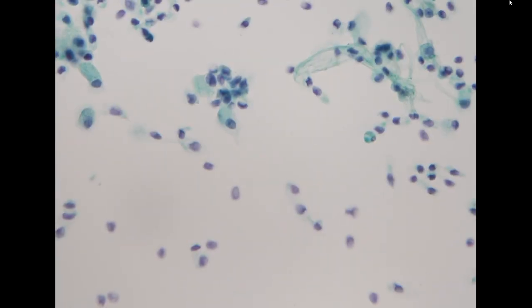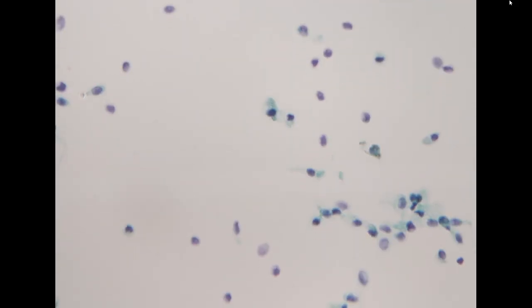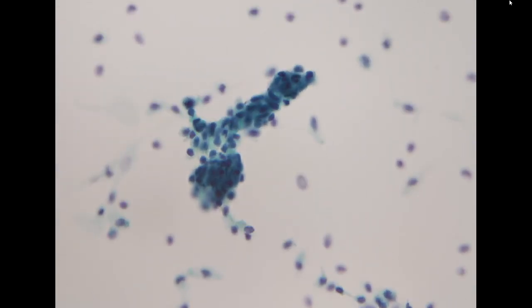and all of these cells have mild atypia, where you don't see a normal NC ratio. The NC ratio is slightly increased, and you feel like most of the cells look the same. This is uniformity, or what we call a monotonous appearance. This is somewhat unusual, particularly for reactive urothelium. When we see the cluster here, we didn't see umbrella cells at the periphery of the cellular fragment.